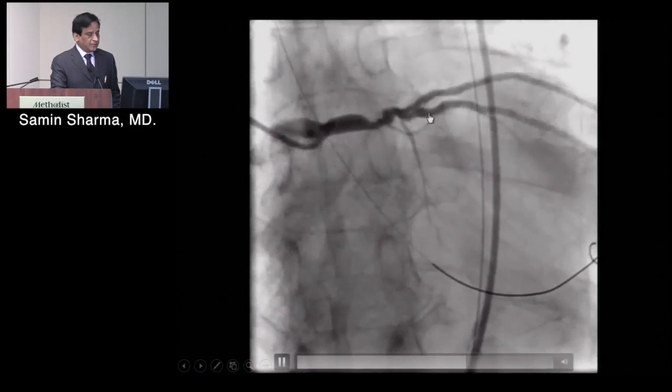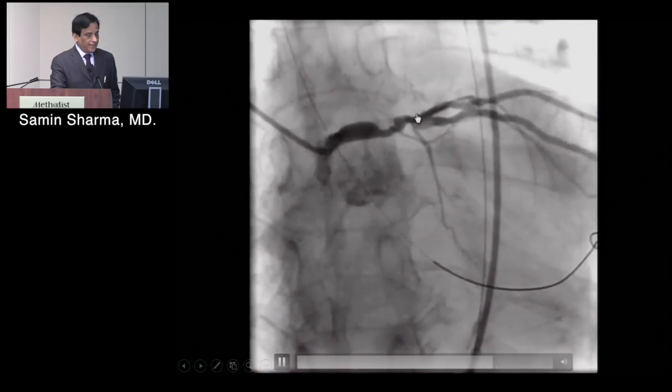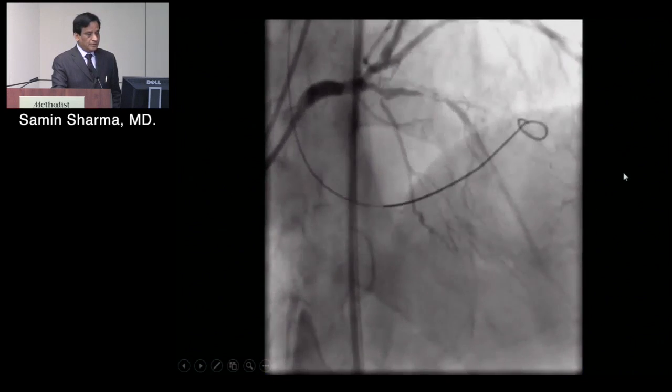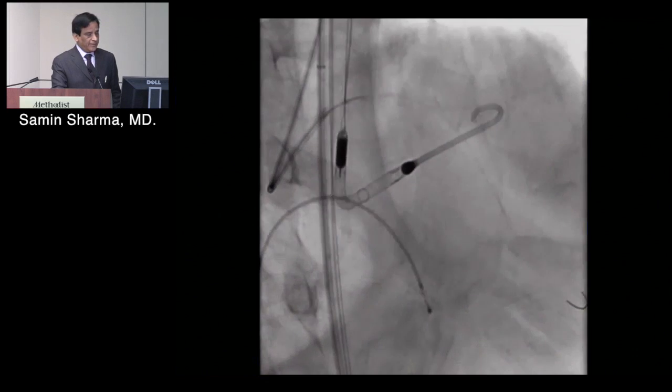Very calcific. This is the severe calcium. Calcific of the left main, tram track, LAD, very slow flow of the LAD. Now you can see in this better view here. Subtotal, this was the live case this year. Right coronary was fine, but again very calcific.